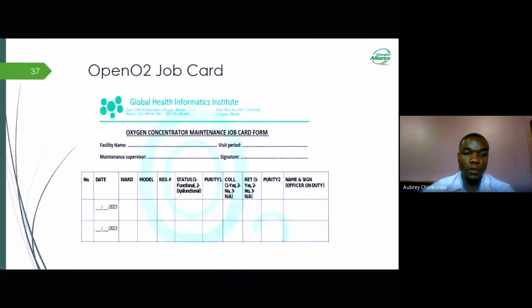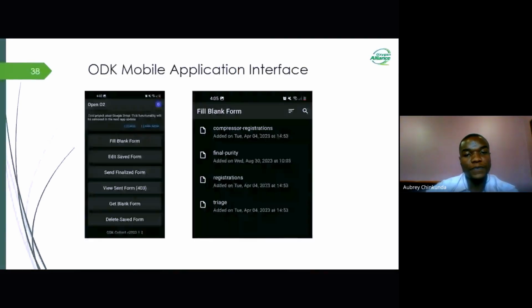From this, we're going to talk about the electronic methods. And as I mentioned earlier, we mainly use the ODK for collecting most of the data, also known as the Open Data Kit. It's an app that's available on App Store or Google Play. You can easily download it to your phone. It's mainly available for Android. So if you want to use it on iOS, you might need to download GIC Collect. But for ODK, it's available for Android.